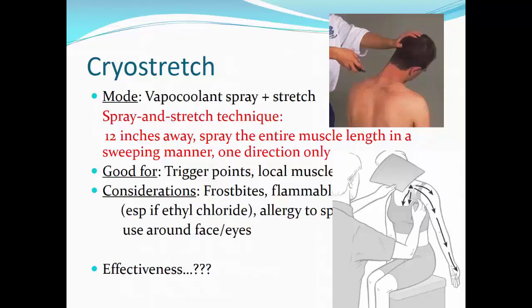If you use this close to the face and eyes, make sure to protect those vital structures. Also, because of the potential of inhaling the spray, have the patient turn their head away. Or you could block the spray from going in the face.